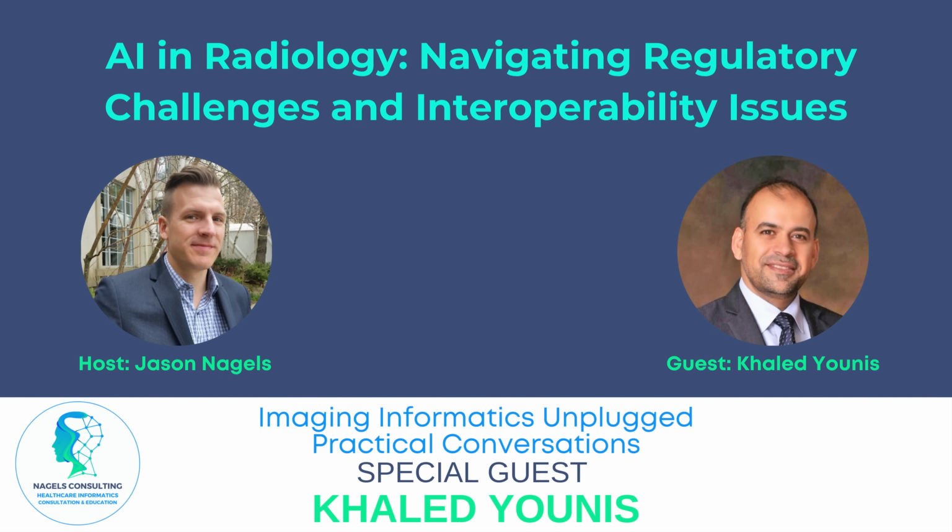Some people provide the output like in a structured report. Some people do it with encapsulated PDF, or some of them do it in a structured report, not following the standards. The reporting is where we focused more in the previous years in IHE, because we felt that this is where the industry is moving and adopting AI in the clinical workflow.